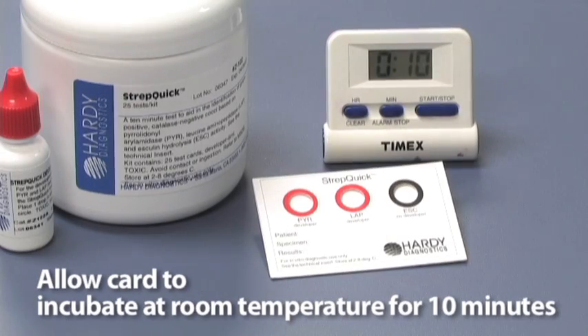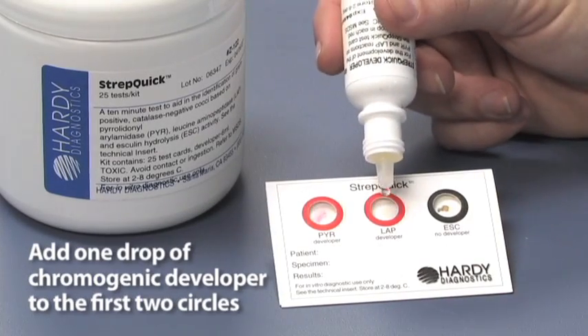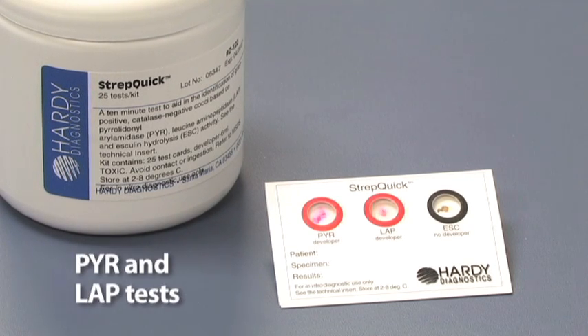Allow the card to incubate at room temperature for 10 minutes. When the 10 minutes are up, add one drop of chromogenic developer to the first two circles, which are the PYR and LAP tests.